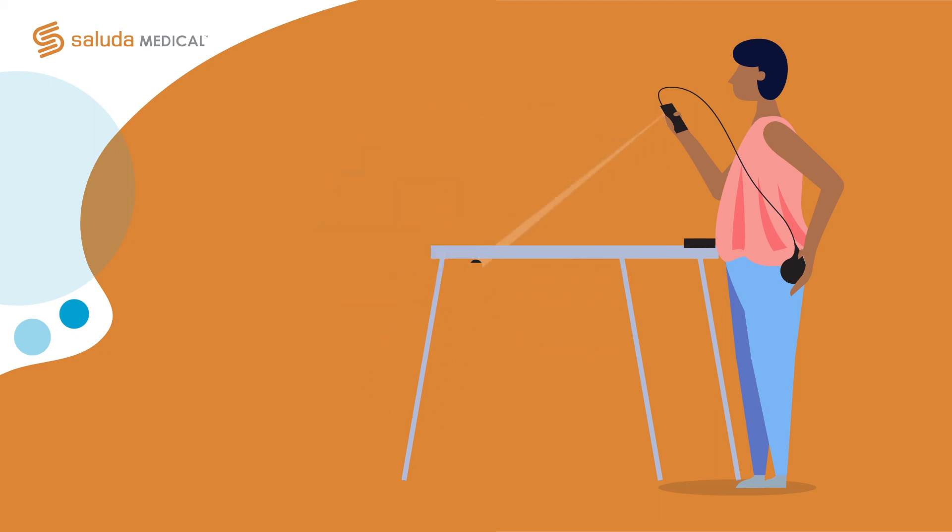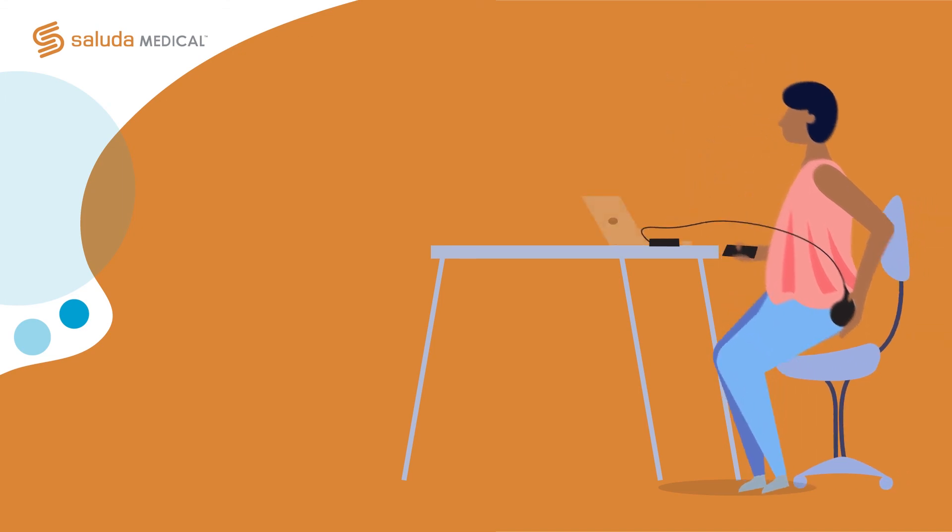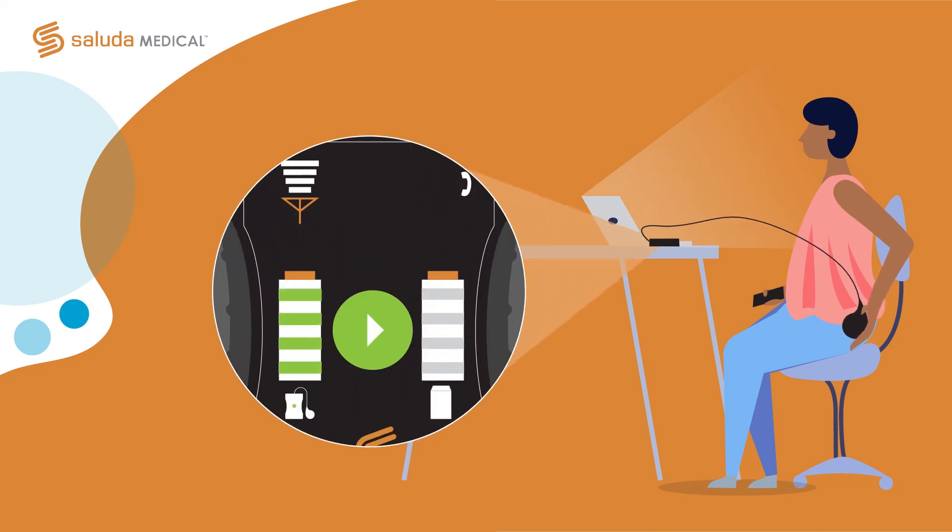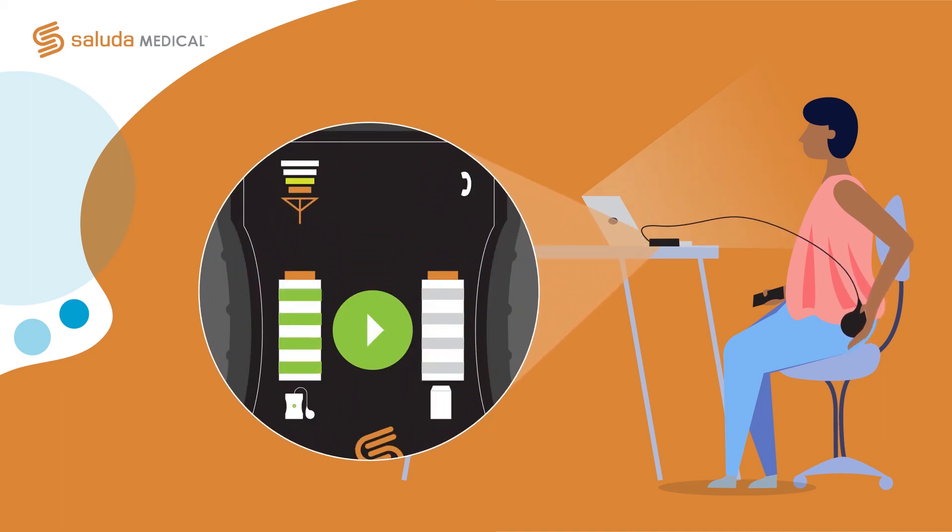You may turn therapy on once charging has started. Keep the charger coil in place over the implant or battery until you have finished charging. The charger will beep once if the charger coil moves out of range. Realign the charger coil so the charging link indicator shows three or four bars.